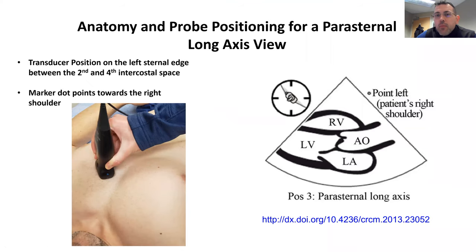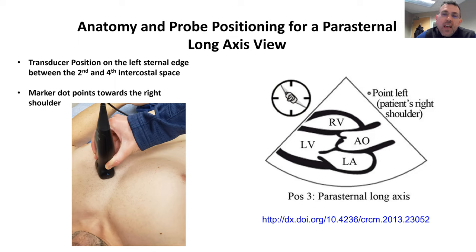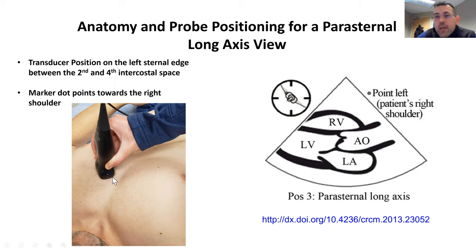First is anatomy and probe positioning for a parasternal long axis view. We want the transducer positioned on the left side of the chest, on the left sternal edge, between the second and the fourth intercostal space. Here we show on the left side of the chest, here's the sternum, and this is approximately somewhere between the second and the fourth intercostal space. We want the marker pointing towards the right shoulder.